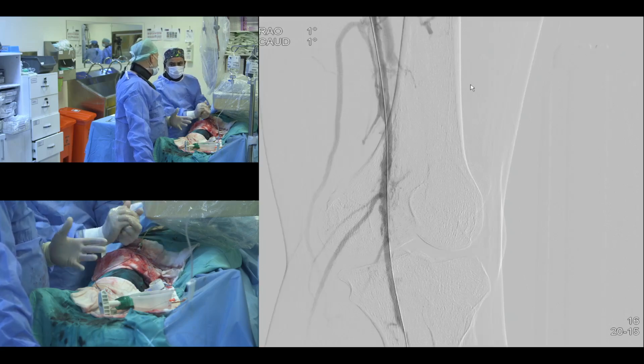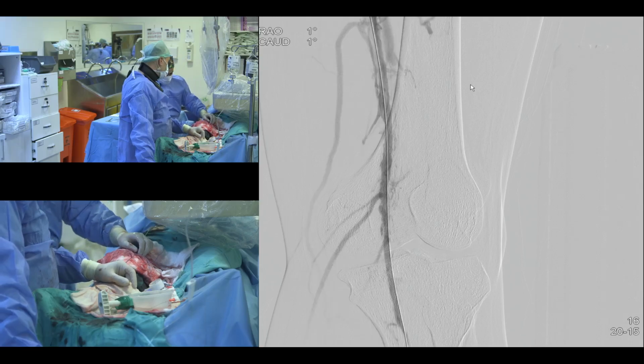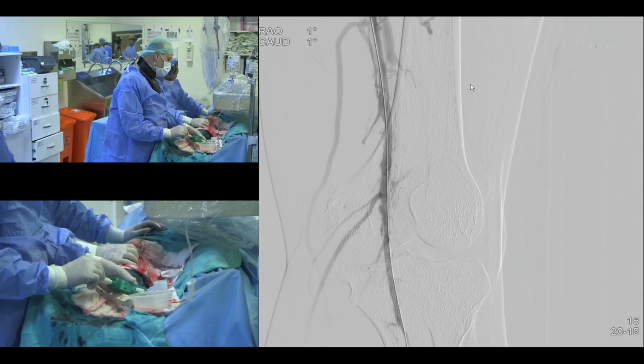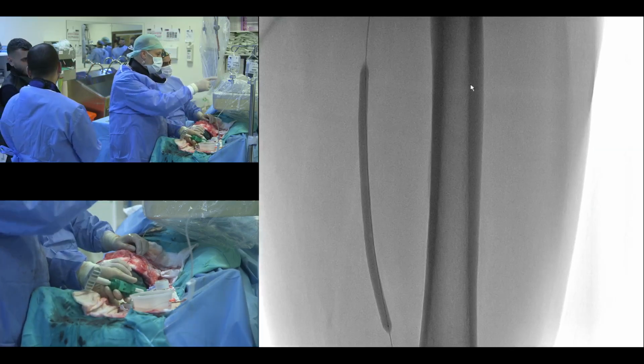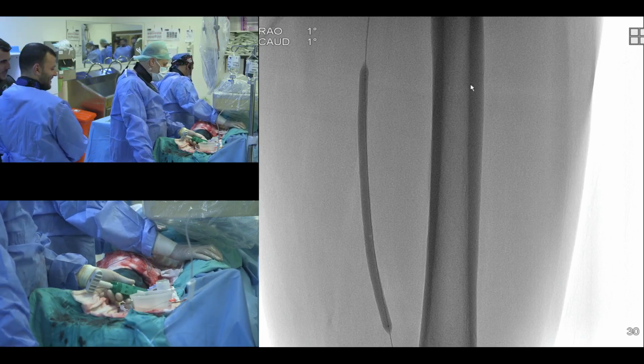Thank you. Yılmaz, which side was the operation? Right or left? Left. You are trying in this left. Yes, at the same time. The index pressure. Are you sure of the operation of the graft? There is no graft. We cannot see it. If it is present, it is an occluded graft.